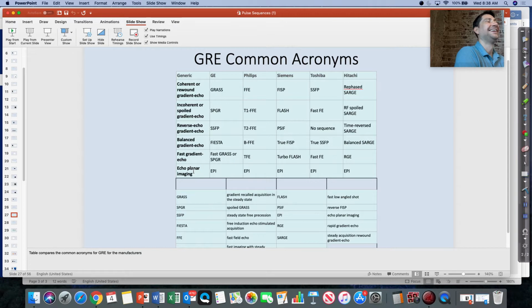Diffusion weighted, because remember, we're trying to catch water diffusing in the brain, and we're trying to see if there's any restricted diffusion. So we use echoplanar imaging where we're scanning very rapidly to try and catch any restricted diffusion within the brain. And the main one is going to be during your acute strokes. So EPI, diffusion weighted imaging. Always relate those.